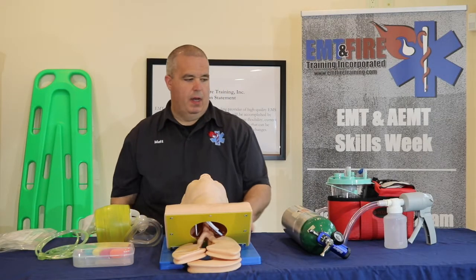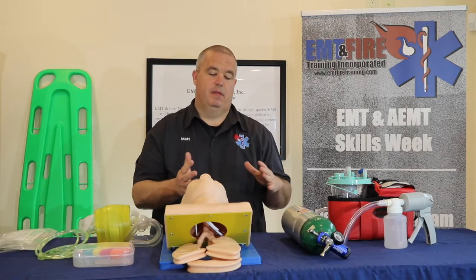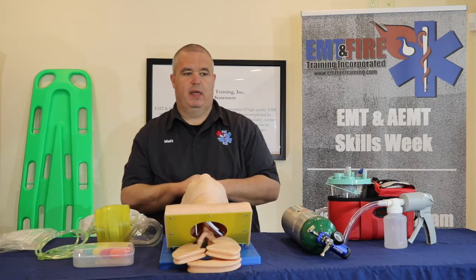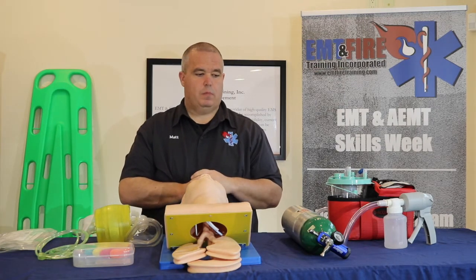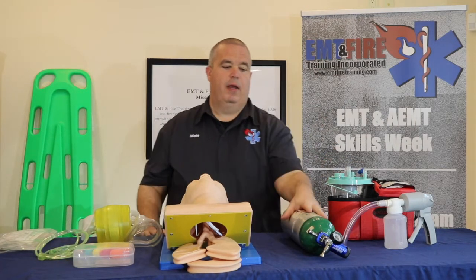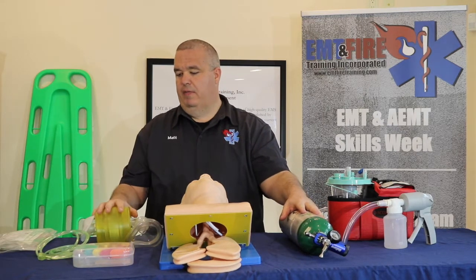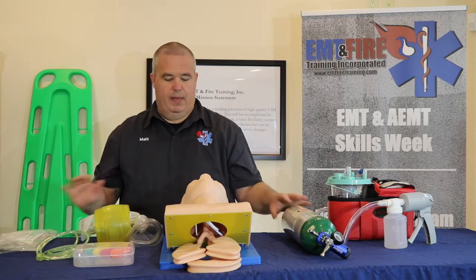We're going to go over how to use a BVM on an apneic patient. We're going to describe the steps we need to take in order to successfully ventilate an apneic patient. I have my equipment here: suction, a full oxygen bottle with a regulator attached, a BVM, some OPAs, and some NPAs.